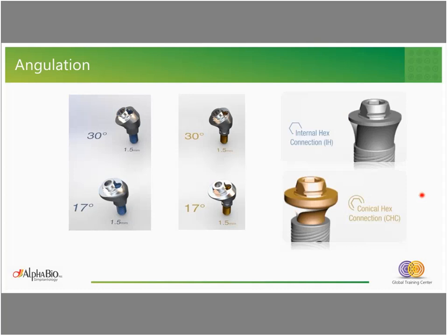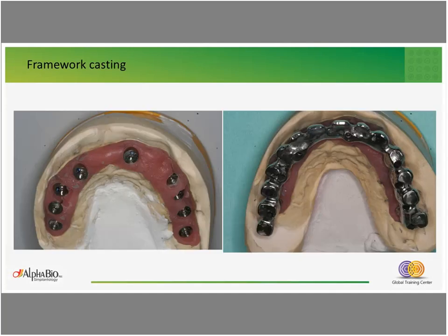The shape of the multi-unit abutment can also positively influence the soft tissue arrangement, and will decrease the amount of resorption around the implants. Back to the case, we have selected angulated and straight multi-unit abutments. Now all the opening areas are inside the occlusal table of the maxilla, and in this area we can connect the multi-unit abutments, and finally we can check the metal frame.